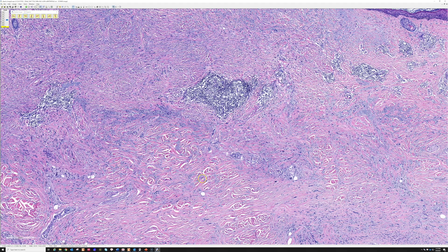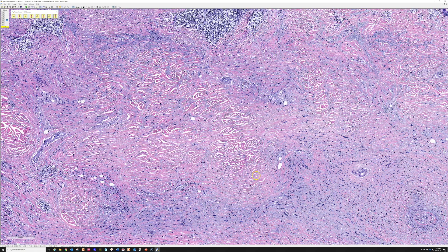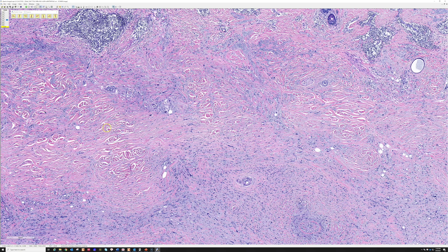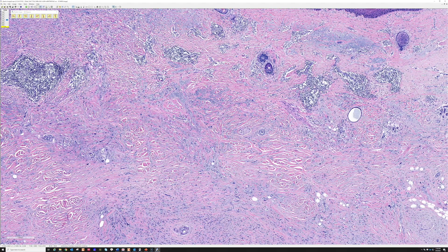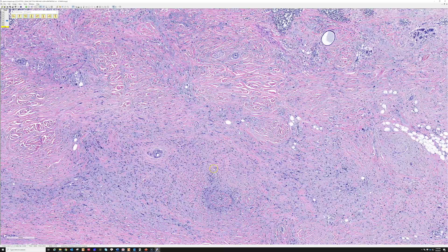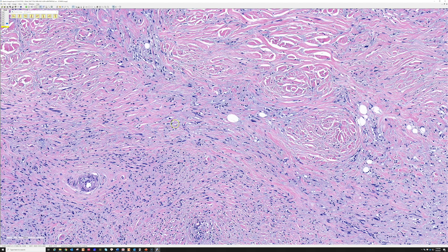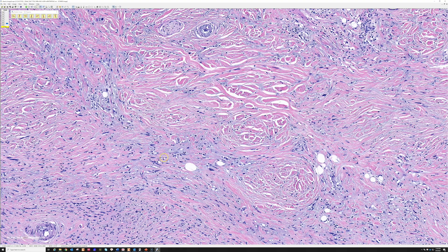The dermis and subcutis are replaced by a hypocellular spindle cell proliferation with a lot of collagen in the background. Some of it looks like normal reticular dermal collagen, but most is new collagen - you can tell because it has a more sclerotic texture with bluish myxoid material. Dermatopathologists often say mucin; pathologists say myxoid - both refer to this blue ground substance, hyaluronic acid. So there's a mixture of pink collagen and mucin in the background.